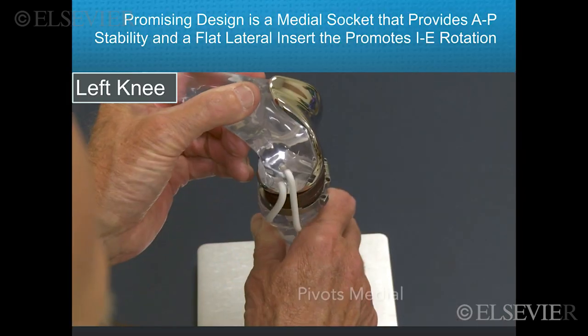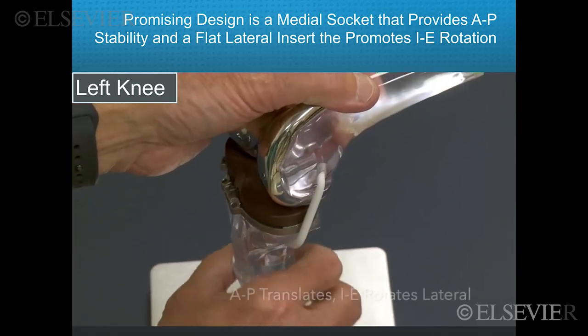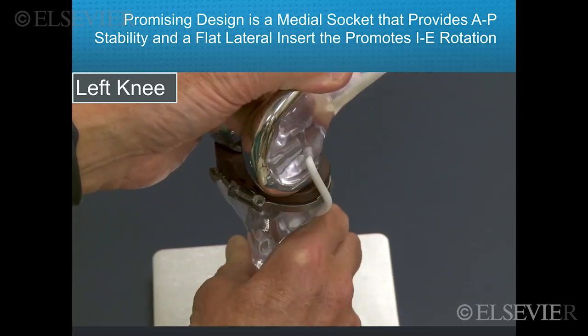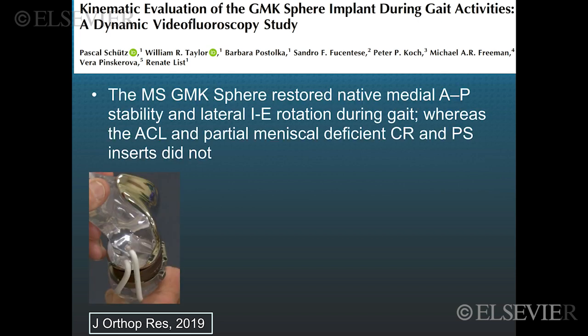So let's look at this movie, and you can see that the AP stability, when there's compression, is provided by the socket medially. The flat lateral plateau promotes internal and external rotation, and the absence of a posterior rim decreases the risk of rim wear as well as instability, as there's no rim to stabilize the knee. A kinematic evaluation of the GMK sphere implant during gait activities using dynamic fluoroscopy by Schutz confirmed this finding.